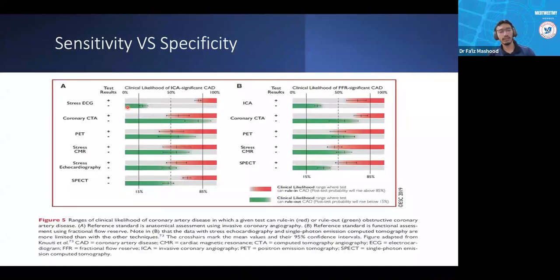So now the question comes in. Why do we need EST? Why can't we just abolish EST from our diagnostic cardiac tests, because we have many other imaging tests that are more sensitive and specific? I understand that concern, but okay, let's go to the next slide now.